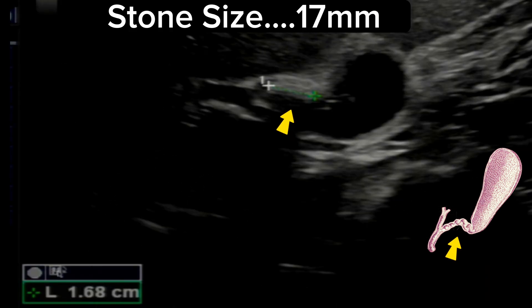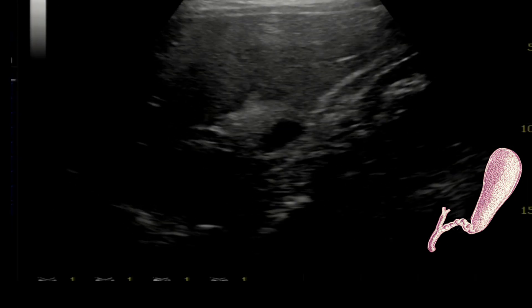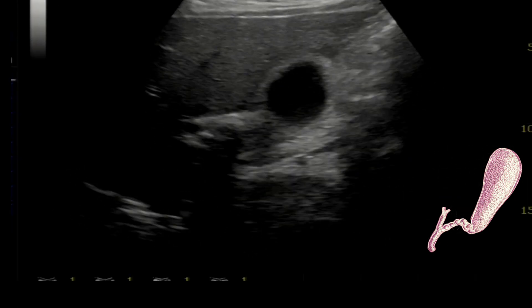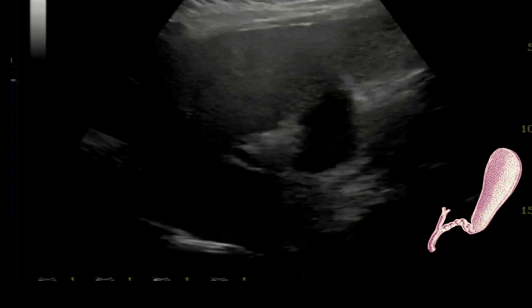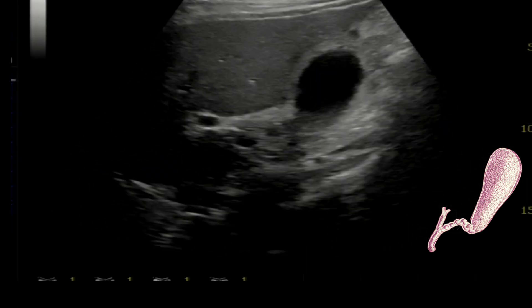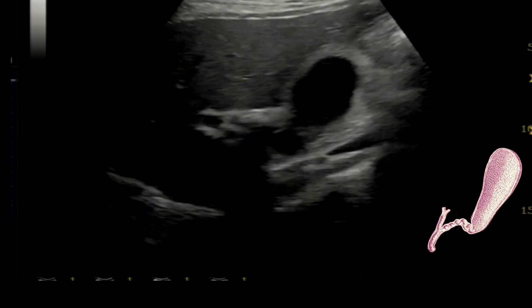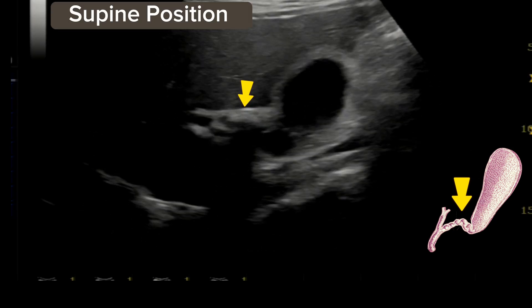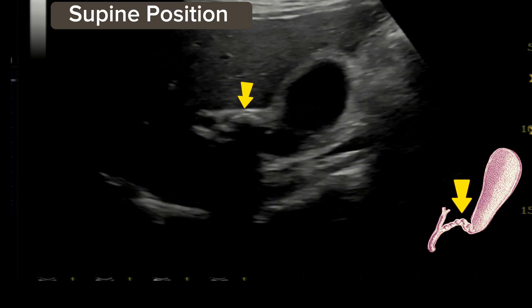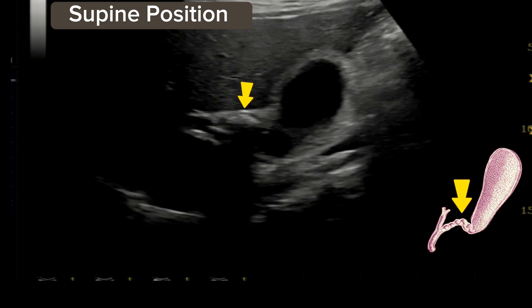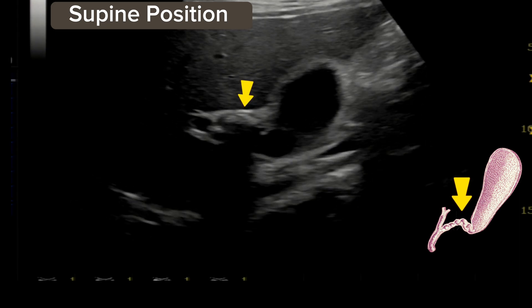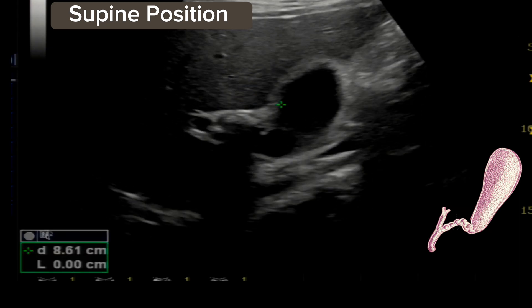When we focus on the neck, we see a large calculus just adjacent to the gallbladder neck. The size of the stone is 17 mm. This is large and is causing the obstruction.